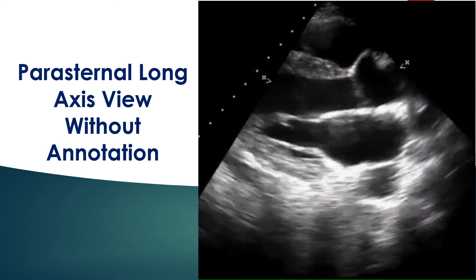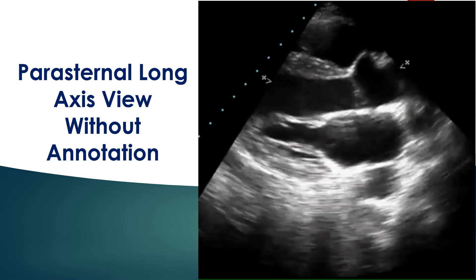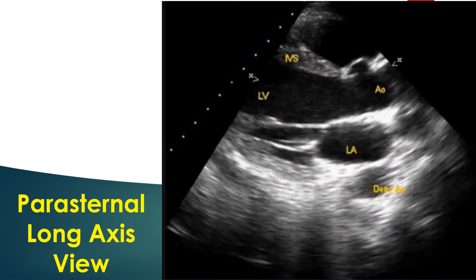In the parasternal long axis view without annotation, a cross section of the descending aorta is seen posterior to the left atrium. The coronary sinus can be imaged if it is dilated and will be visible in the atrioventricular groove. A dilated coronary sinus would suggest a persistent left superior vena cava draining into the coronary sinus.